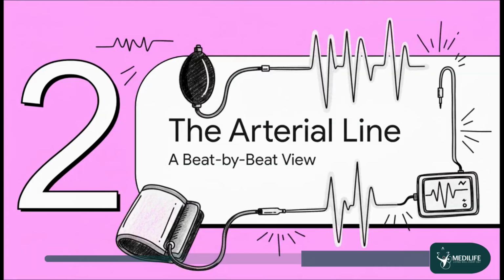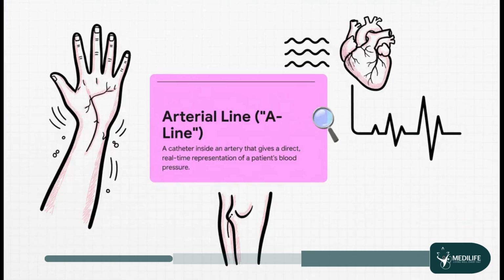All right, let's move on. You know how a regular blood pressure cuff gives you a snapshot in time? Well, the arterial line gives you the whole movie. You get a continuous, real-time look at the blood pressure, second by second. An A-line is just a tiny, thin catheter that we place directly inside an artery, usually the radial artery in the wrist or sometimes the femoral artery down in the groin. This gives us a direct, unfiltered measurement of pressure inside the arterial system with every single heartbeat.